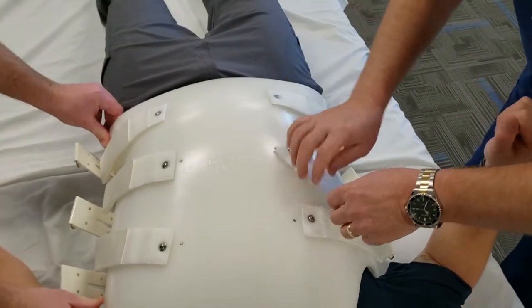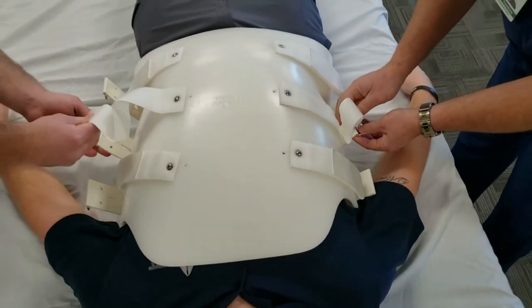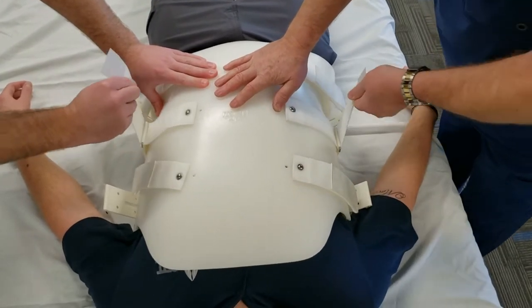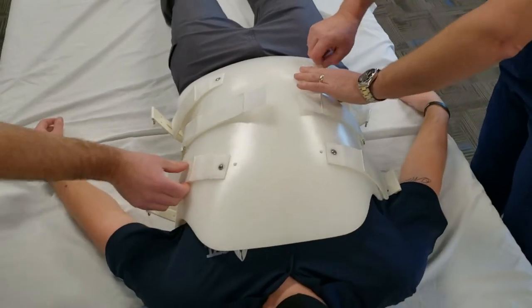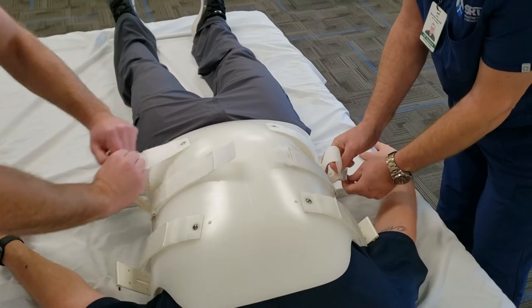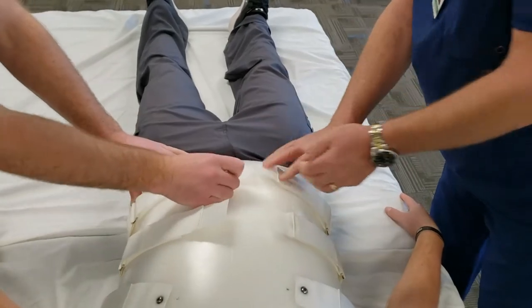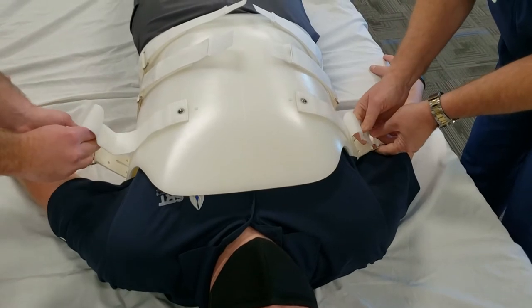We're going to start with the center strap first. I typically ask the patient to take a deep breath and hold it, and then we're going to fasten the straps snugly. You can relax that breath. We're going to move down to the bottom and do the bottom strap next — have him take a deep breath and hold it and fasten. Then we're going to move to the top and do the same thing there.